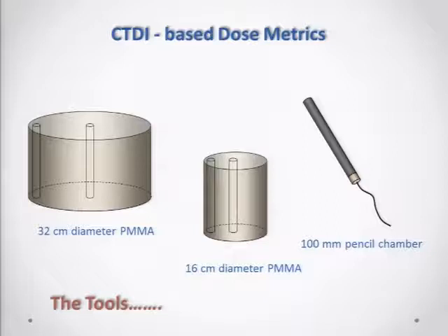Nevertheless, it is encoded by the IEC, the International Electrotechnical Commission, and as a result, the CTDI is a part of the laws of many nations around the world. And getting rid of it, therefore, will take decades if we, as a community, decide to get rid of it, and that's unknown at this point.